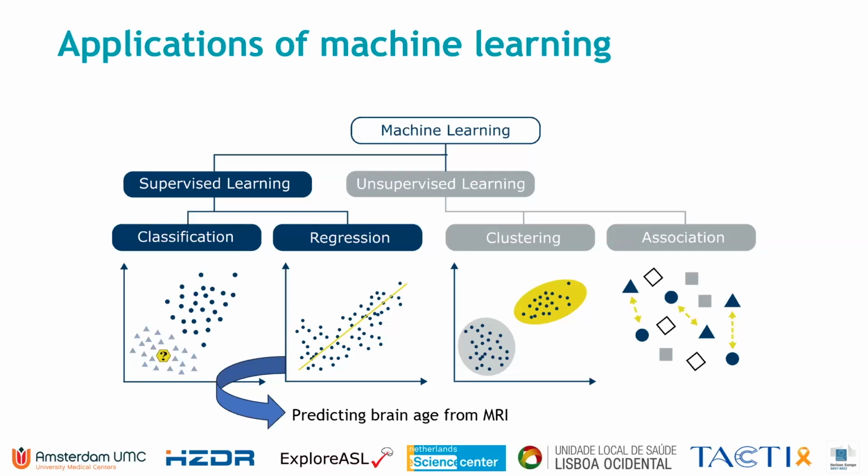So regression is often the goal as well if we use this in brain age prediction, because age obviously is a continuous variable. I'm just showing it to you so you have a sense of how it's being used as well. There's also unsupervised learning, in which we feed the data to the algorithm, and then it detects the patterns and such by itself.